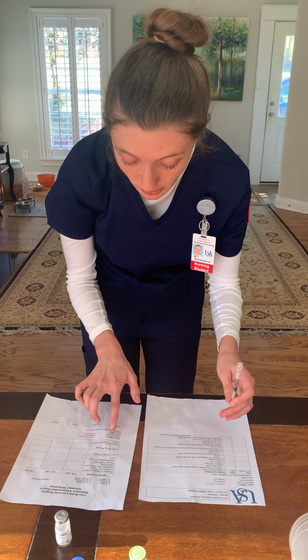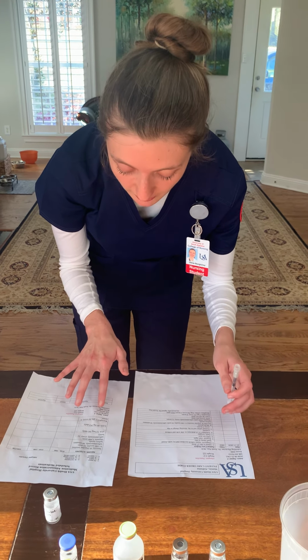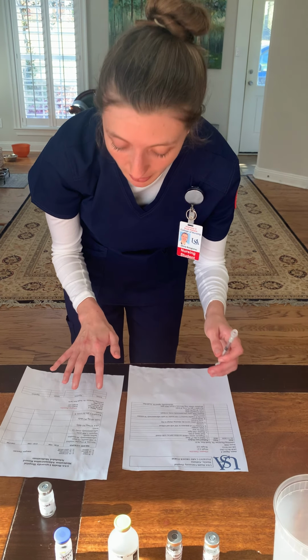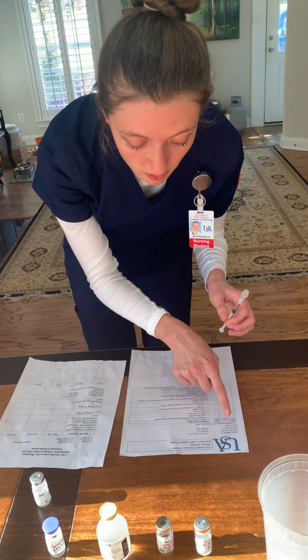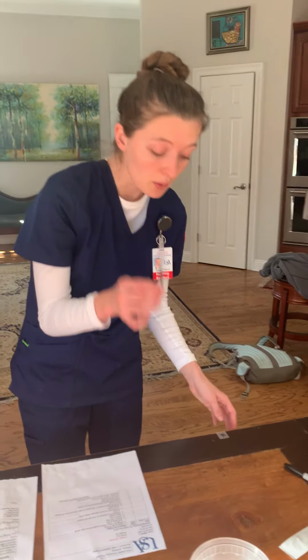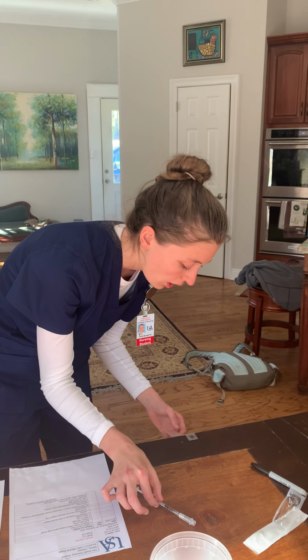And then I would check that Jaguar Jones is, I would first do that, I apologize. I would first check that Jaguar Jones is my patient at the medical record number 4176352. Medical record number 4176352 matches. I'm now placing my syringe down with the safety cap on.